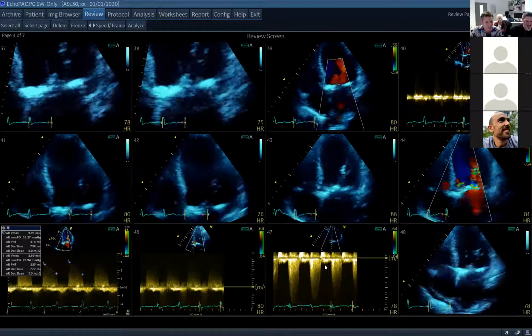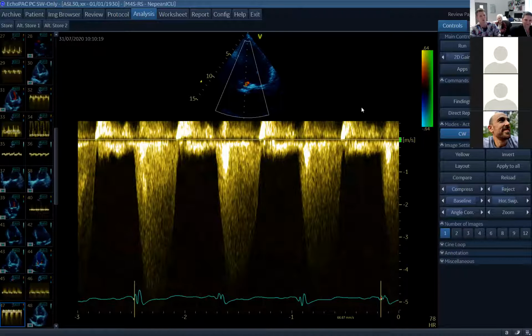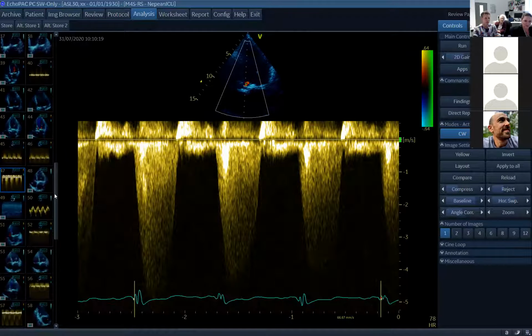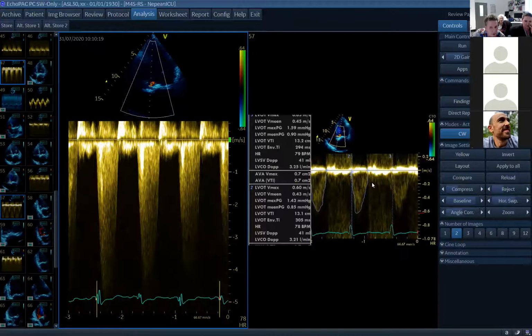Don't forget to do that. And it was that one there. So someone's obviously trying to have a look. So my question for you is, is that mitral regurge or aortic stenosis? If it's mitral regurge, there'll be isovolumic contraction before the flow. Very nice. And then the shape would be the other, but it's mainly the duration. So good notes, the duration, right?